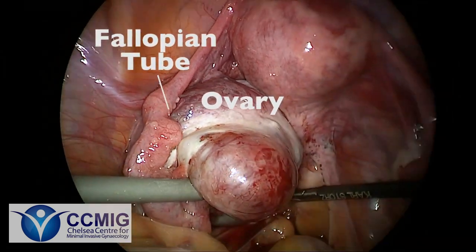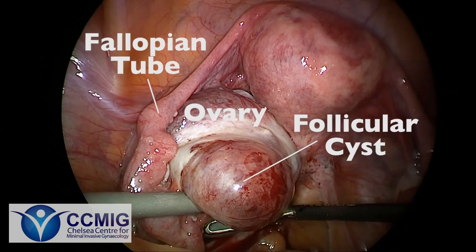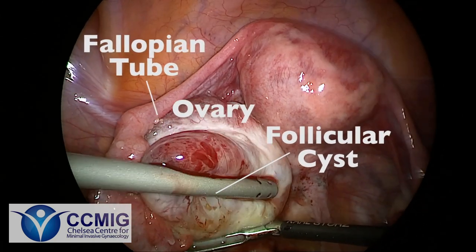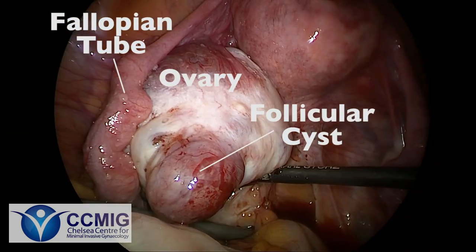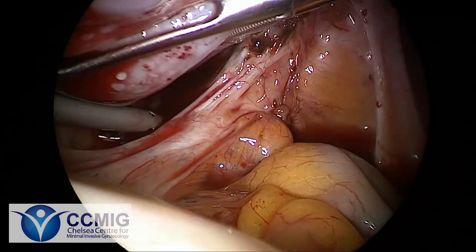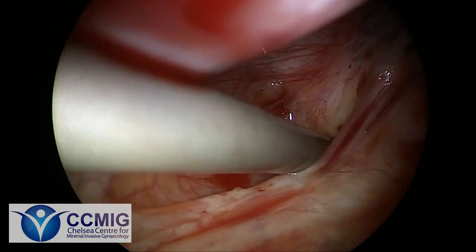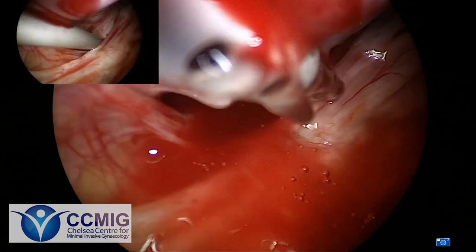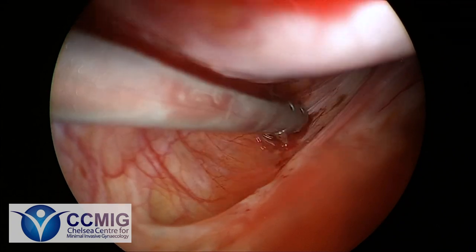A little bit of pressure on the cyst, and you can see that it releases some clear fluid. This cyst is probably nothing to worry about. Underneath however, the ovary is significantly enlarged and heavy and stuck down in the left pelvic side wall to the peritoneum around it. You can see the adhesions and scar tissue on closer examination here. A little bit of pressure on the cyst has caused some leaking of fluid, but now we're going to incise it and see what's inside.